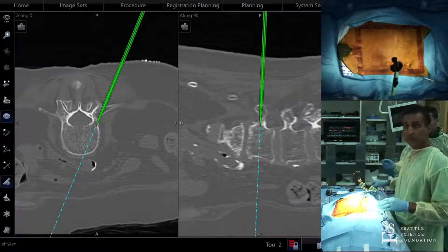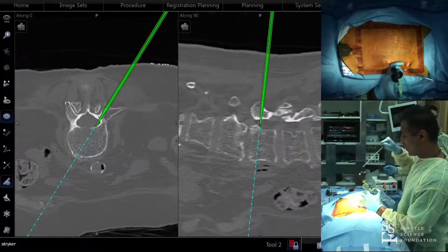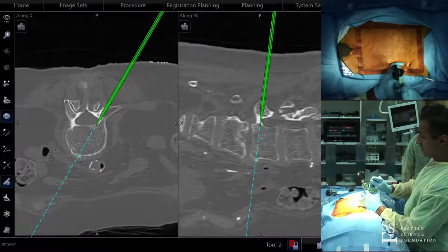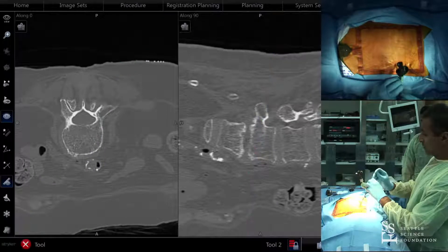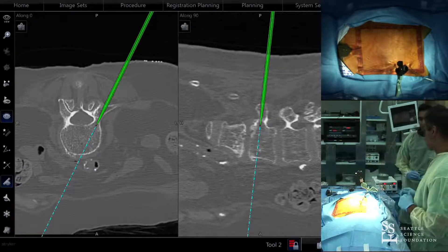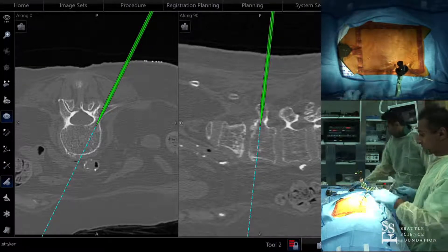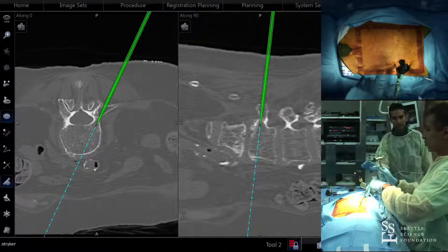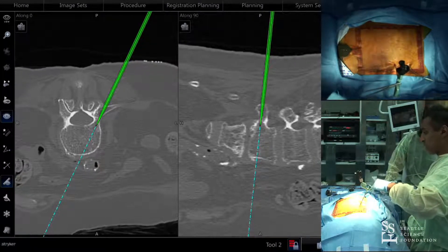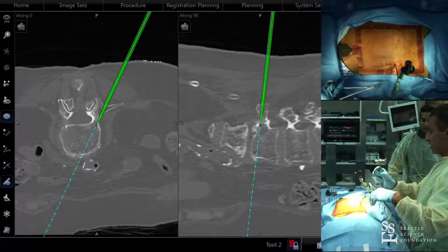For re-scanning indications: the only times I re-scan are if I'm doing a long construct and feel we haven't captured enough, or if I'm doing a navigated lateral surgery and I re-scan when we flip — and obviously if there's ever any question. I use navigation for 100% of my cases now, including decompressions. Another helpful feature is that you can merge the intraoperative CT scan with your preoperative MRI, so for discectomies and decompressions, I'm essentially navigating the MRI.